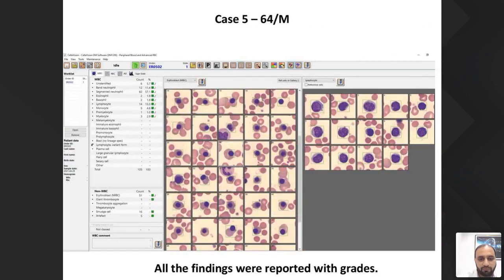I have kept this slide specifically to compare two cell types, that is nucleated RBC and lymphocytes from the same sample. Now here you can very well see that none of the nucleated RBCs were misclassified as lymphocytes. So all the nucleated RBCs were nucleated RBCs, only those two cells were something else which were classified. So for lymphocyte, it was almost 100%.